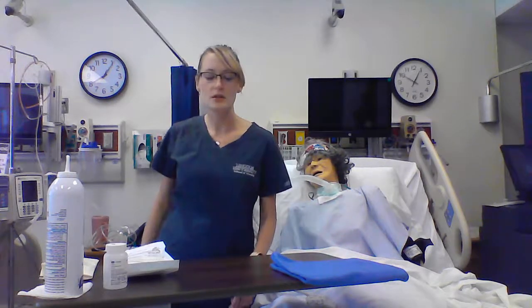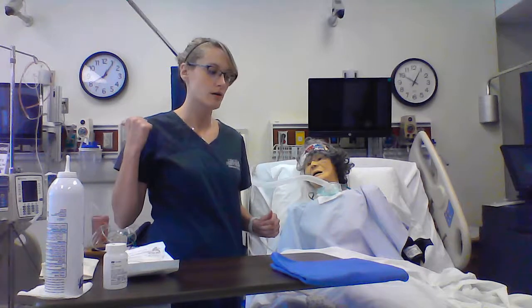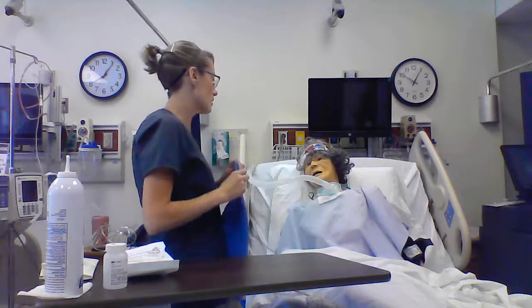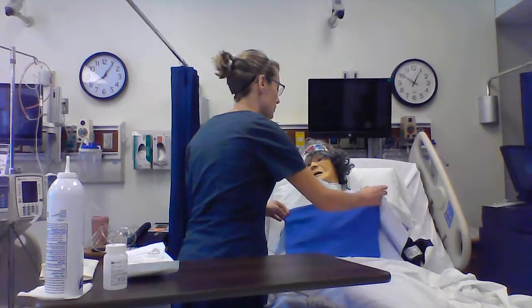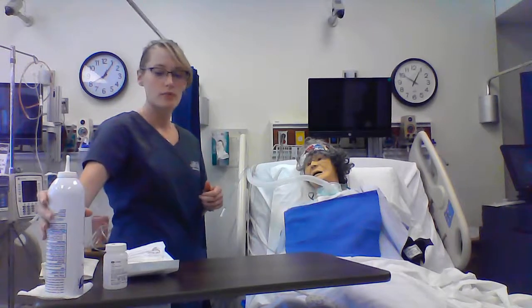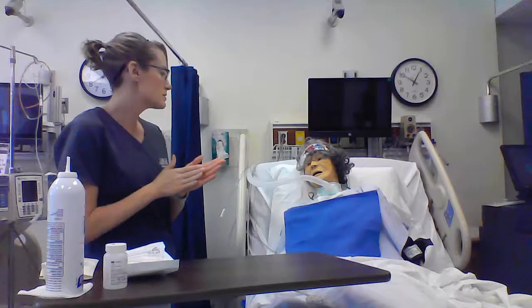I'm not going to pull it for the sake of the video because all of my suction equipment and oxygen tubing is back there. So once we're ready to get started, I'm going to go ahead and drape her with a towel so we keep her gown as clean as possible. I'm going to perform some hand hygiene and clean my hands up.